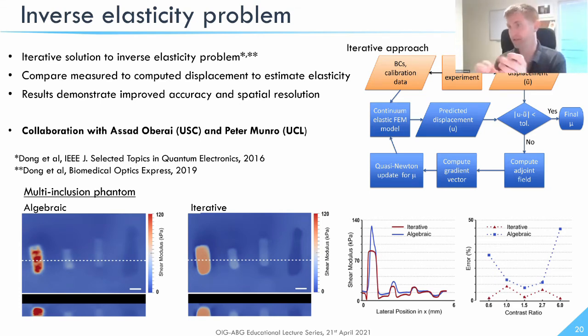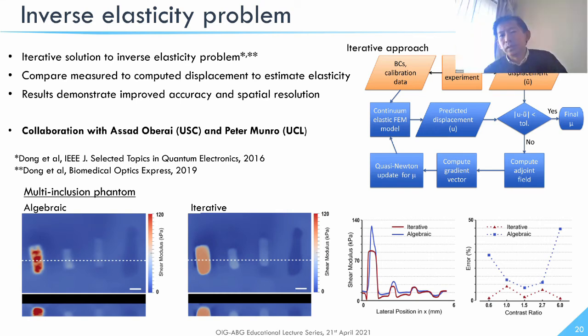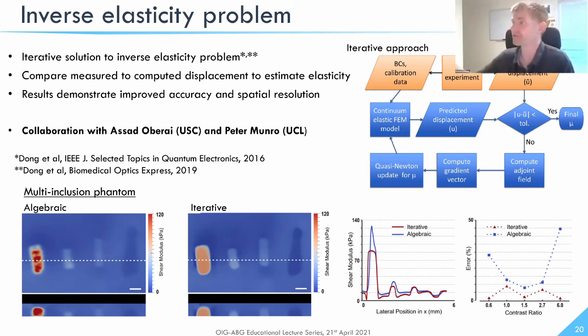And I think the reason for that is that effectively the blood that's constrained within a vessel will act like a solid material, right, because it's incompressible and constrained spatially, so it leads to deformation. What I'm concerned about is that it might lead to an elevated stiffness that we misinterpret as tumor. But that's the reason why we wanted to map the microvasculature, so that we can identify where they are, so that we won't be misled by the elasticity measurement in those locations.